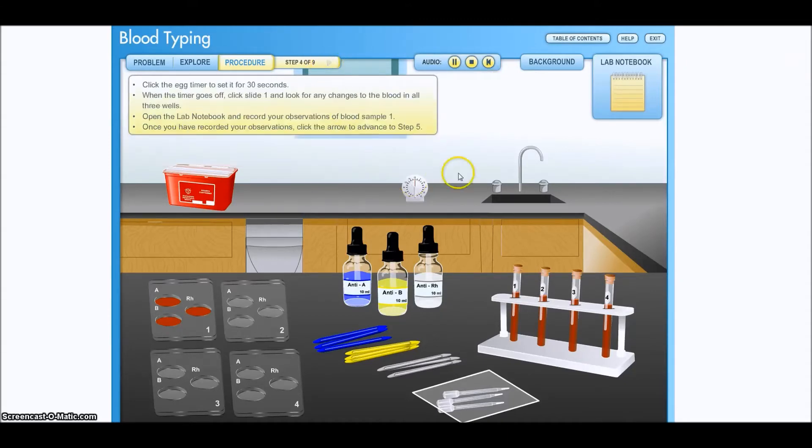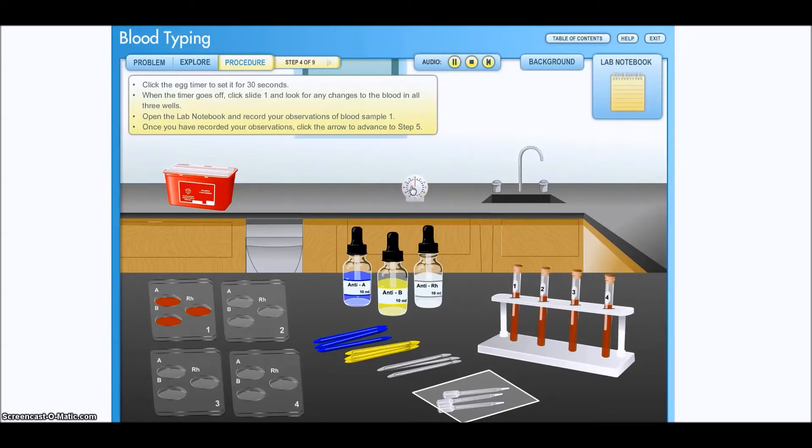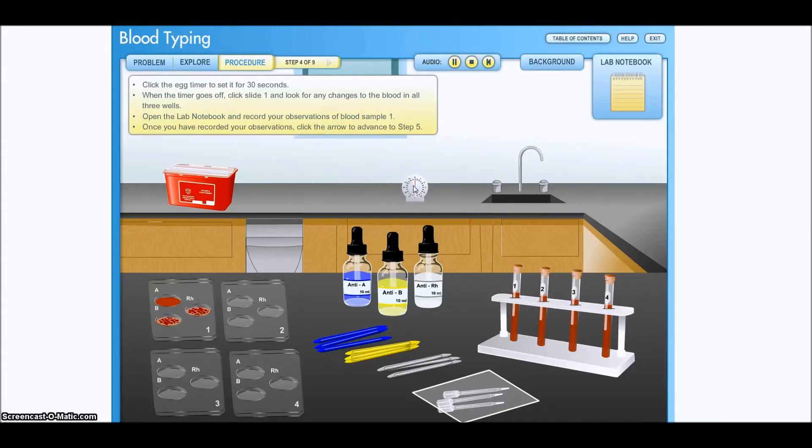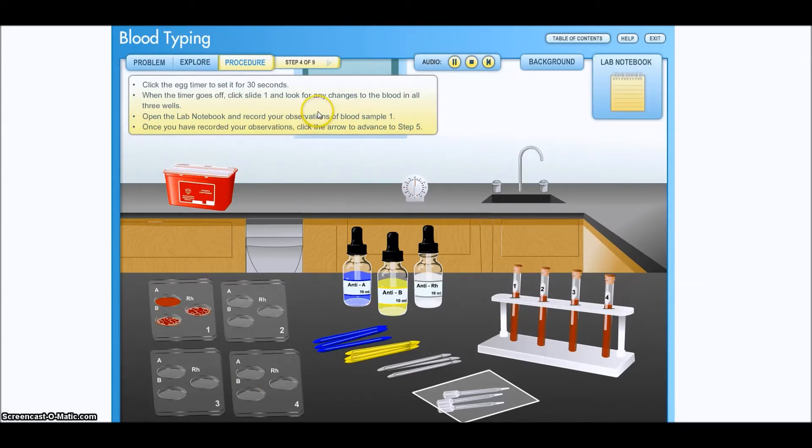Click the egg timer to set it for 30 seconds. When the timer goes off, click slide one and look for any changes to the blood in all three wells. Open the lab notebook and record your observations of blood sample one. Once you have recorded your observations, click the arrow to advance to step five.